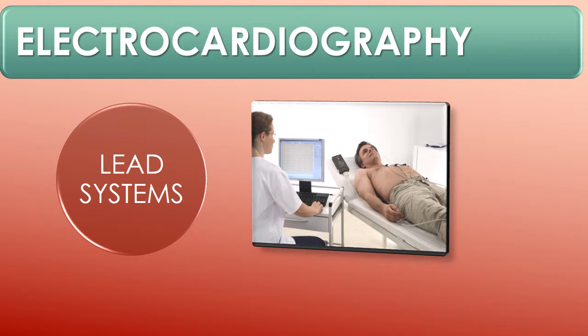The standard 12-lead ECG system looks at 12 views of the heart, like I said. It has 6 limb leads, and it has 6 chest leads, or precordial leads. In your notes, I included a reference for you to know how to place those leads.